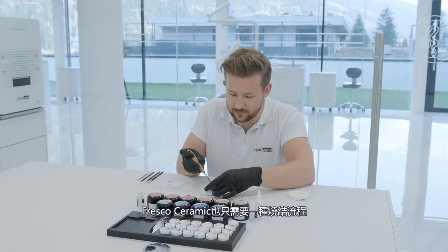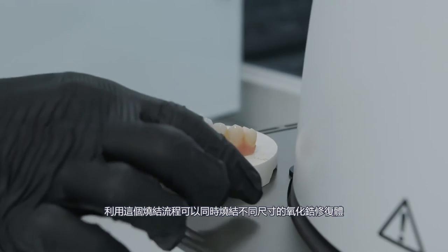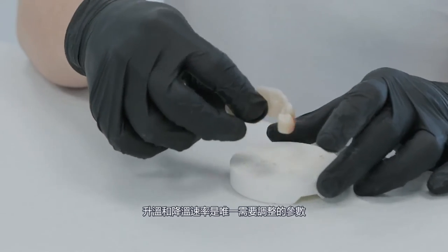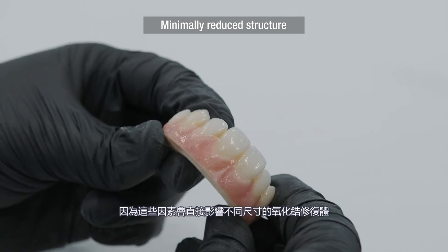With Fresco Ceramics, only one firing process is needed. This special firing process allows zirconia structures of different sizes to be fired simultaneously. Heating and cooling rates are the only parameters to be adapted, as they are directly related to the size and mass of the zirconia structure.